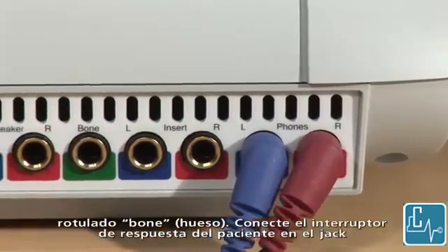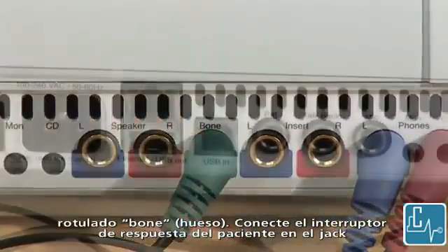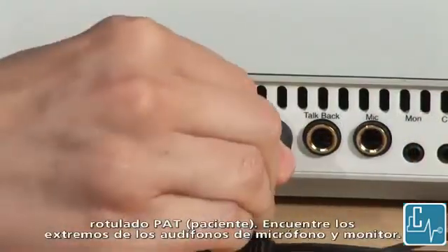Insert the green jack of the bone oscillator into the jack labeled bone. Insert the patient response into the jack labeled PAT.